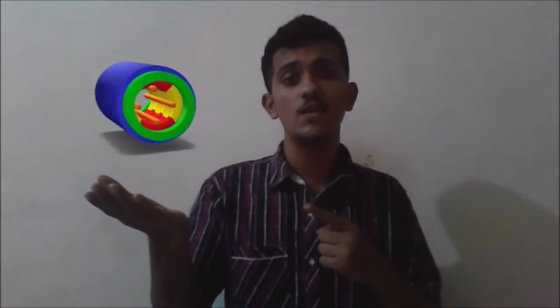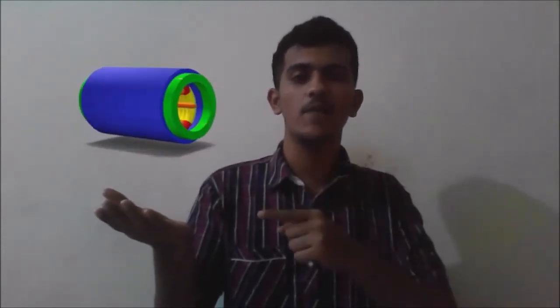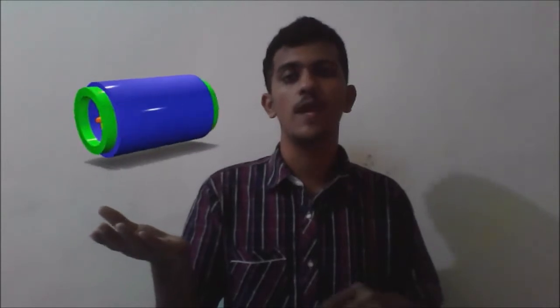This is the general structure of an MRI machine. The blue cylinder you see is an extremely powerful electromagnet, inside which coils are placed parallel vertically and horizontally to each other, shown as red and yellow. These are responsible for producing slight changes in the magnetic field on the inside, which is responsible, as we saw, for the rate of rotation of a hydrogen atom. This allows us to take pictures along various axes.